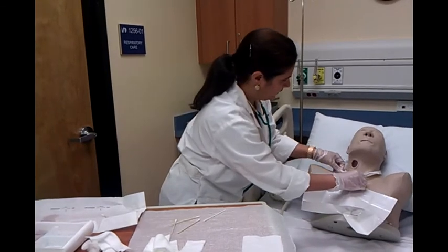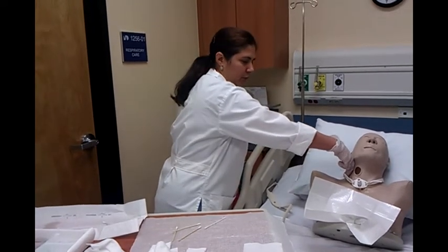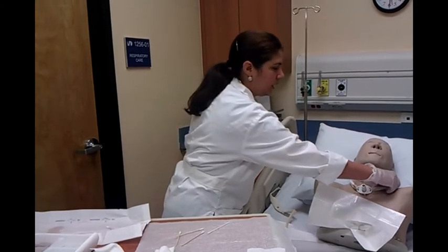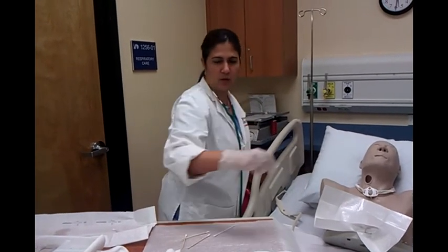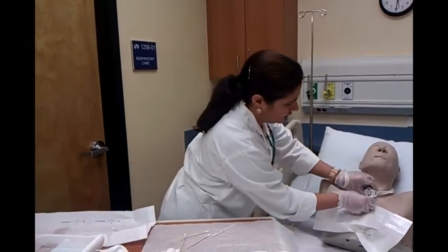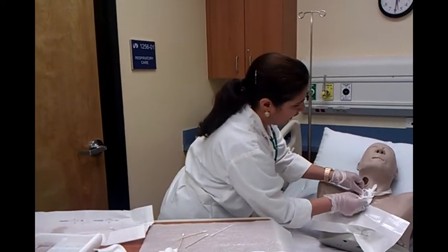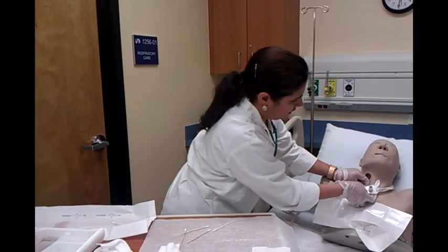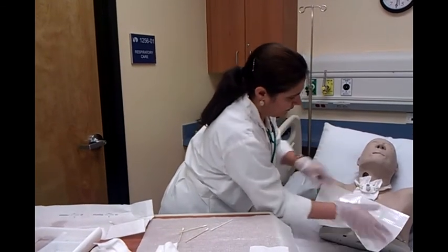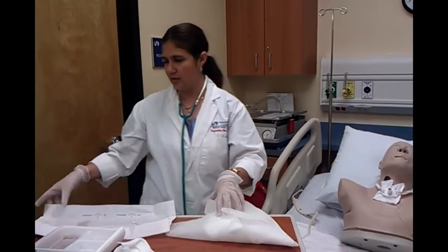After I put the new tie around his neck, I have to check. I put two fingers between the tie and the neck to see if there is enough room and it's not too tight or too loose. And I'm going to put the new gauze around the correct one. It goes here to protect the flange and the skin. After I'm done, I have to throw away everything I used in the hazardous bag.